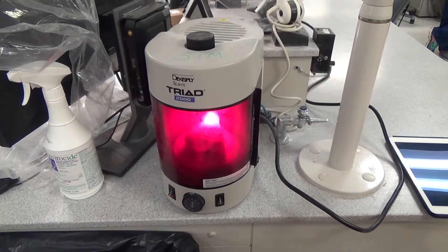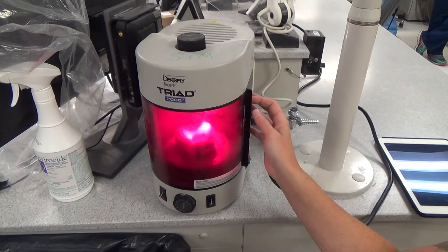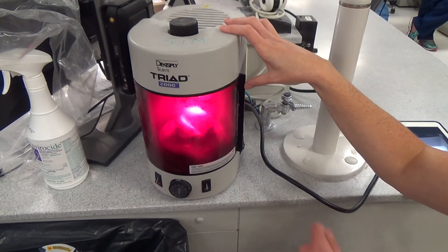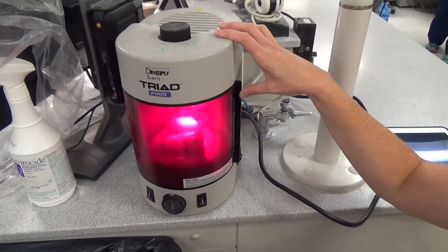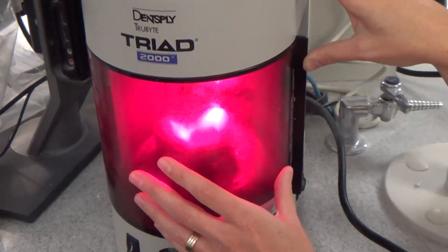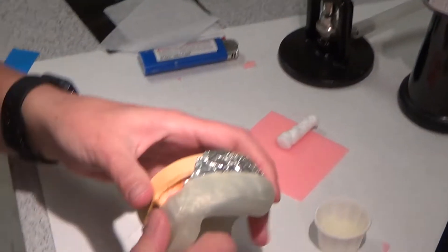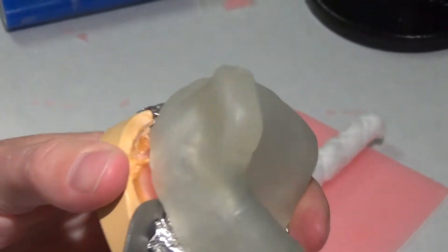I'm actually going to not let this cure all the way just for sake of time. I'm going to let it cure for about 30 more seconds, and then I'm going to show you how to peel the inside of it out. I'll do it at the desk so you can see it on the screens too. So if we've eliminated our undercuts, this should pull off of here pretty easily — it's still going to be nice and snug.